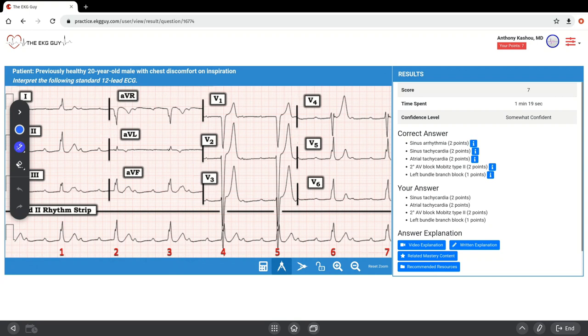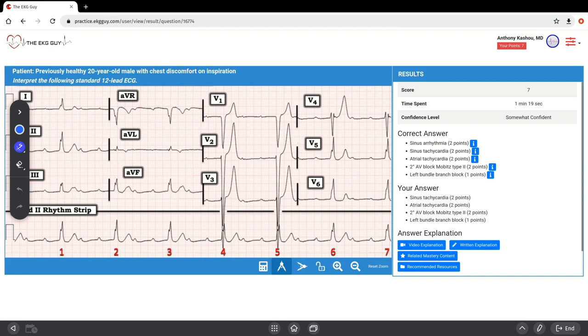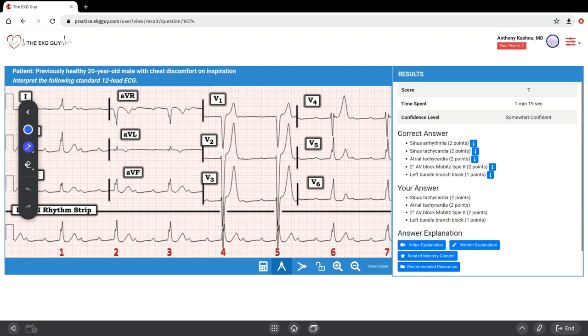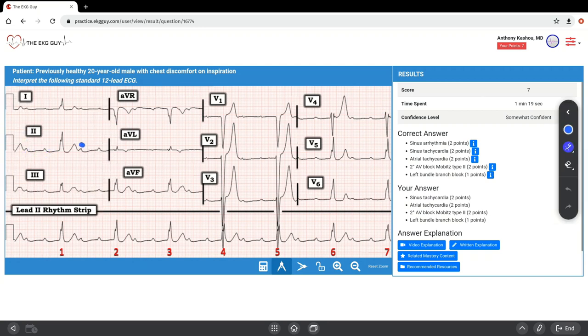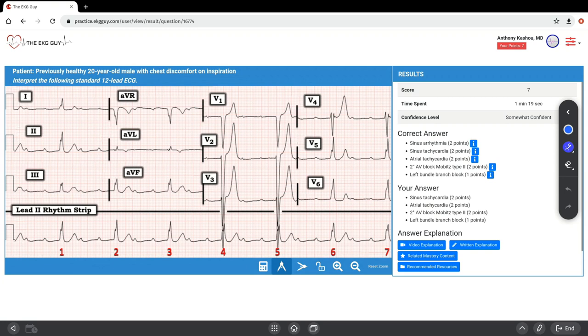The fairly regular wide QRS complexes suggest a possible supraventricular or ventricular rhythm. However, while the QRS complexes are wide, it appears all QRS complexes result from conducted atrial activity. The P waves appear sinus in origin, evidenced by the upright normal P wave axis. We see upright P waves in lead two and constant P wave morphology. Here's lead two, and see these upright P waves. This is also the lead two rhythm strip. The morphology is fairly constant with sinus rhythm, with an atrial rate above the normal adult range.